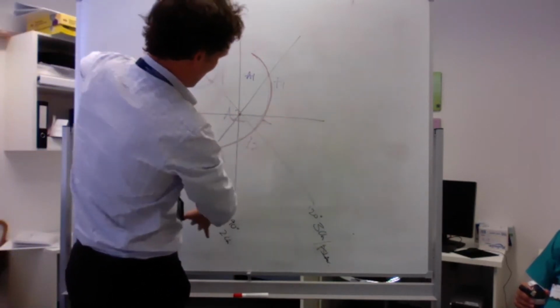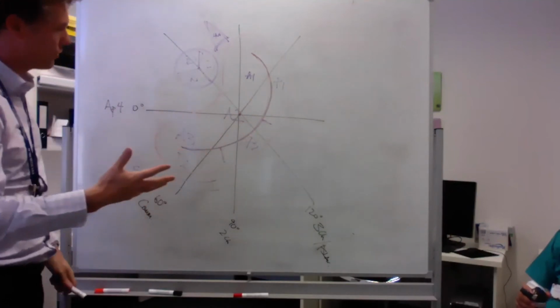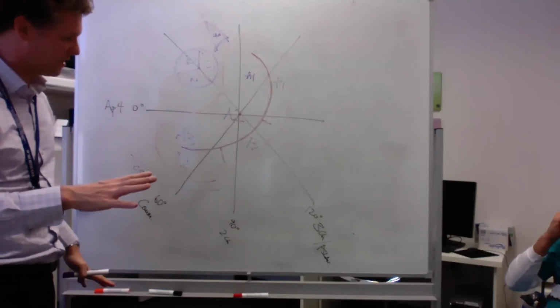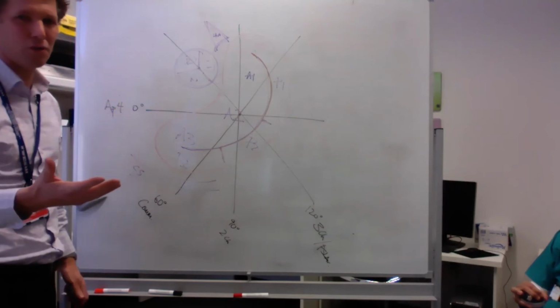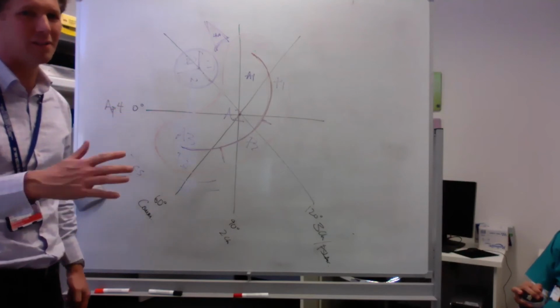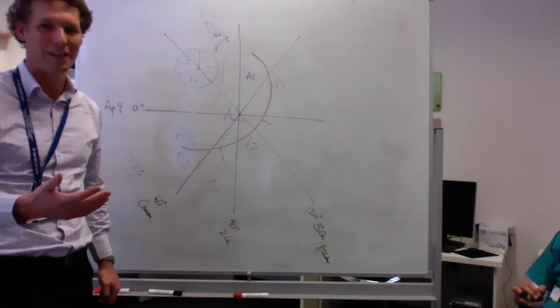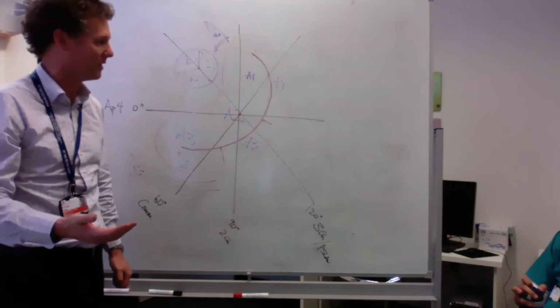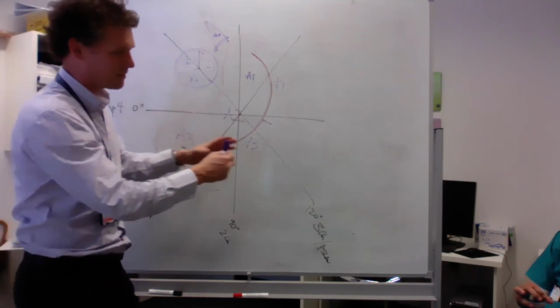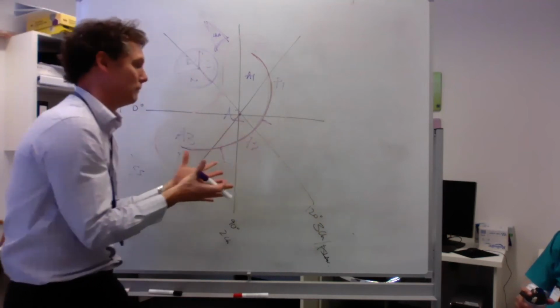And again, you can move that. Of course, it's going to be a little different with everyone. This is a picture I have in my head, and I'm sure people who are doing a lot of time must agree with me that sometimes patients just don't read the textbook, do they? And you're finding your apical 3-chamber view at 135 degrees or something. But I think that's about what it is.